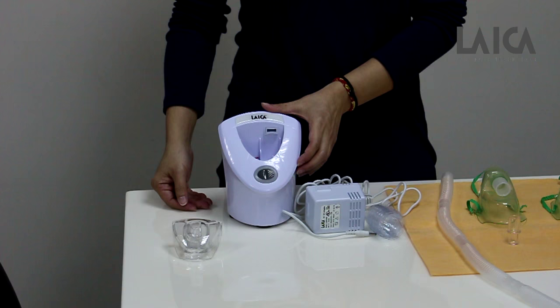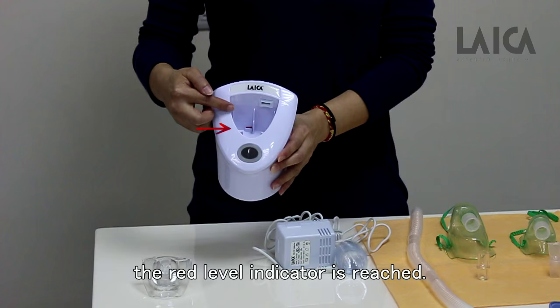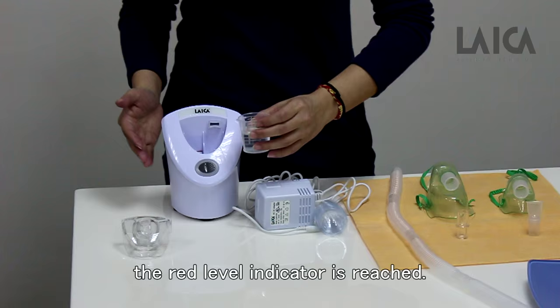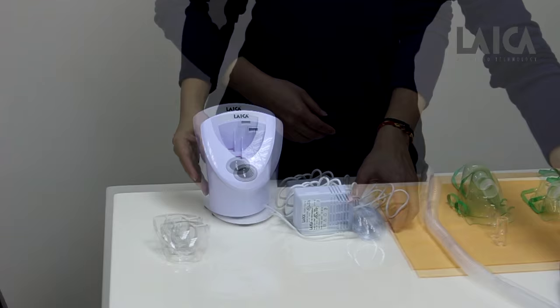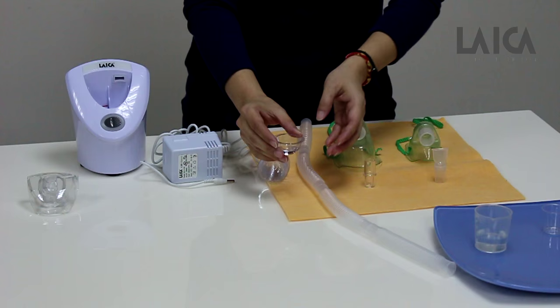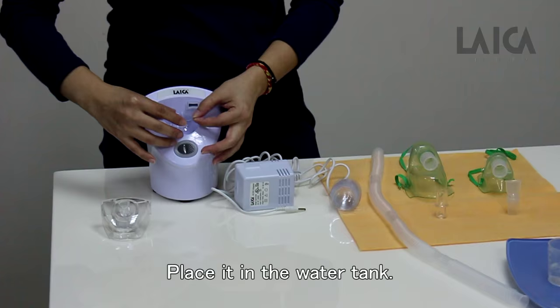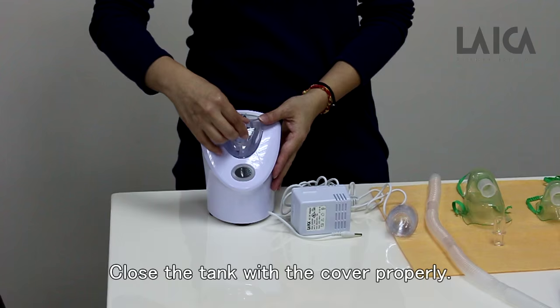Fill the water tank with water until the red level indicator is reached. Put your medicine in a disposable medicine cup. Place it in the water tank. Close the tank with the cover properly.